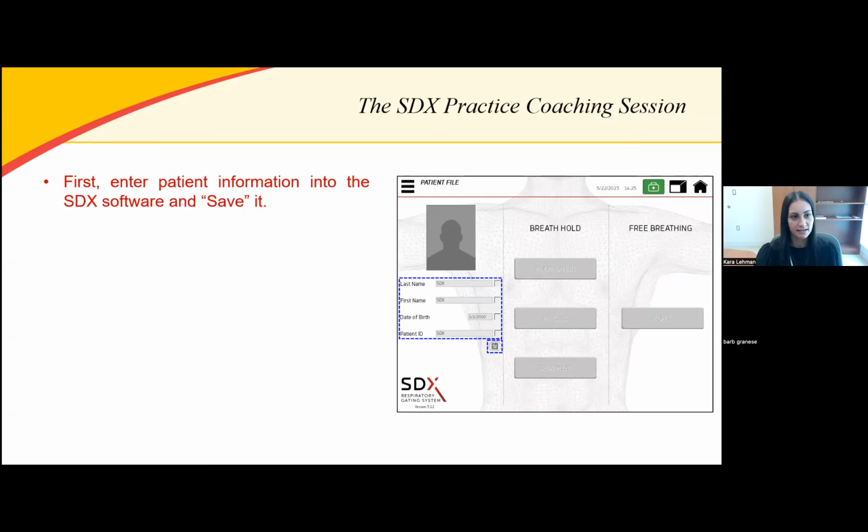So, beginning the SDX practice coaching session, I like to break this part down into two major parts. For the first part, we are trying to obtain the patient's maximum lung capacity and assign a value to that. So what we'll do is have the patient take a deep breath in and hold for a few seconds at their deepest breath level. And then we have the patient do that 3 times.